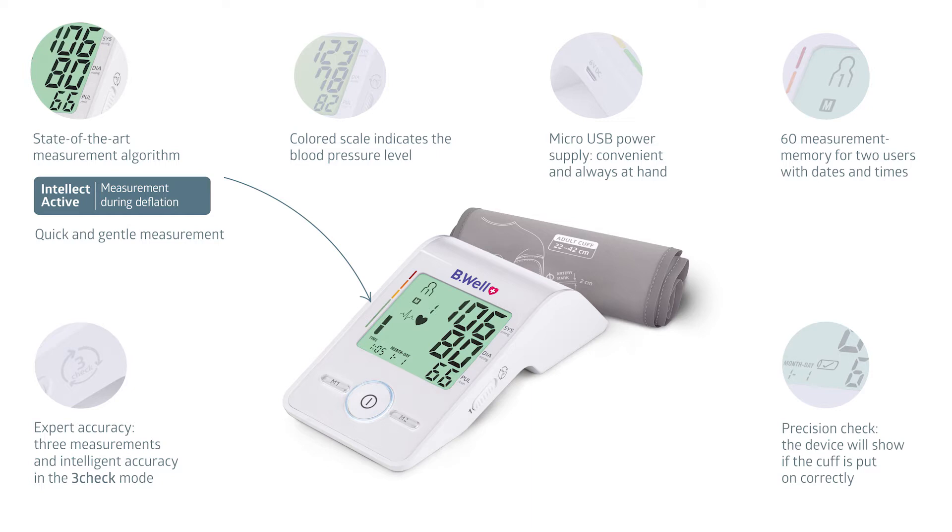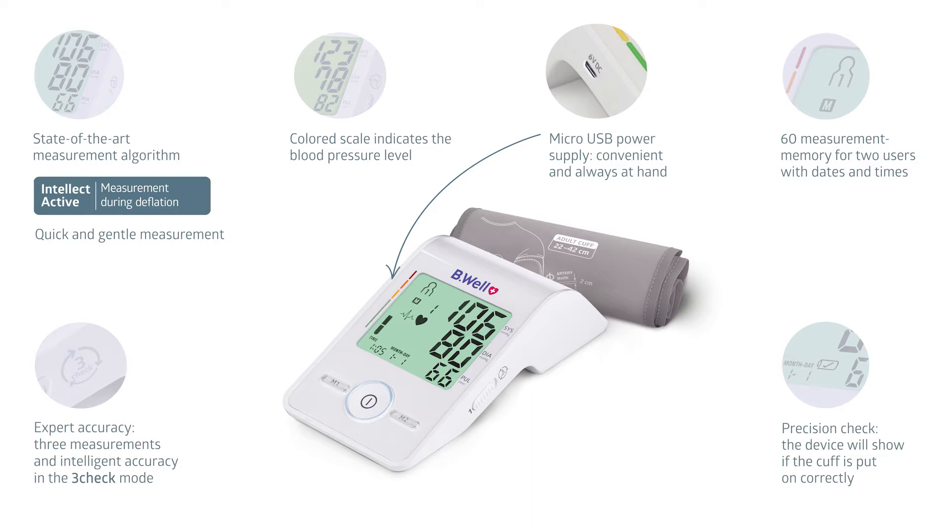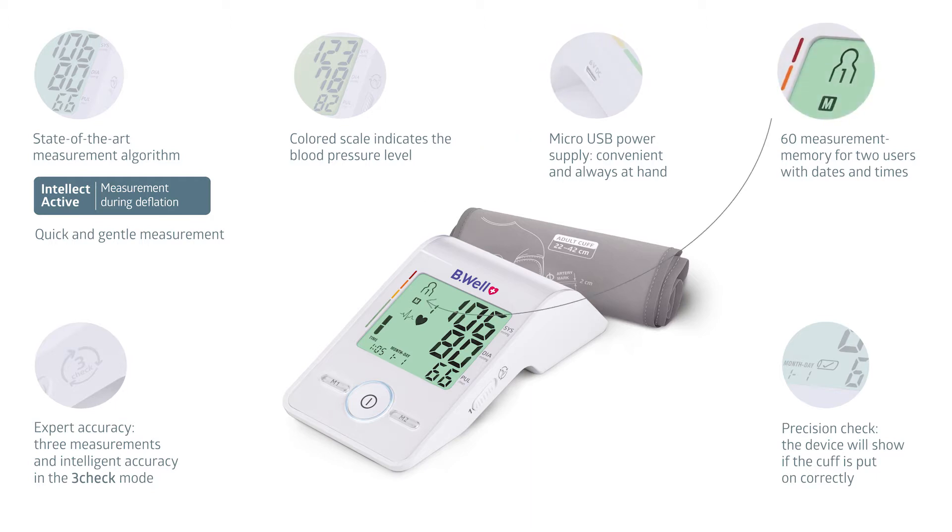With Be Well, blood pressure measurement will be accurate, fast, and gentle. The device can run on batteries or a standard micro-USB adapter — you can use your phone or tablet adapter to operate the tonometer. Med55 will ensure full pressure control for two, with a memory of 60 measurements for each of its two users, with dates and times.